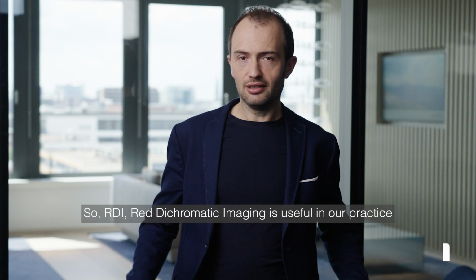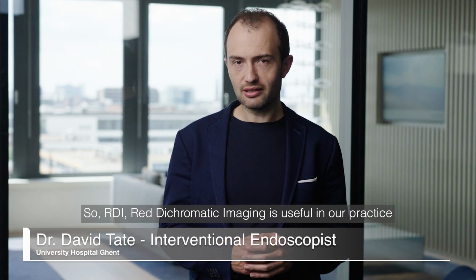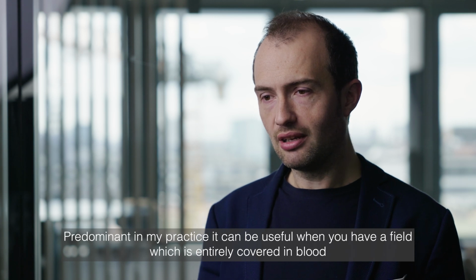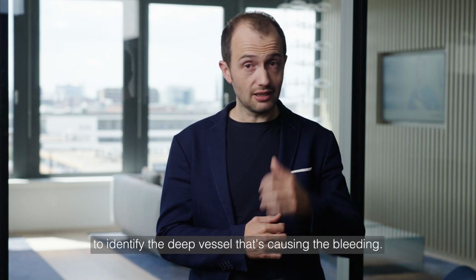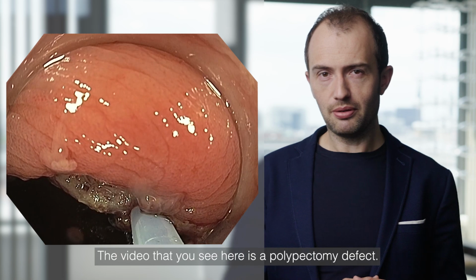So RDI, red dichromatic imaging, is useful in our practice to identify the source of bleeding. Predominantly in my practice, it can be useful when you have a field which is entirely covered in blood to identify the deep vessel that's causing the bleeding.